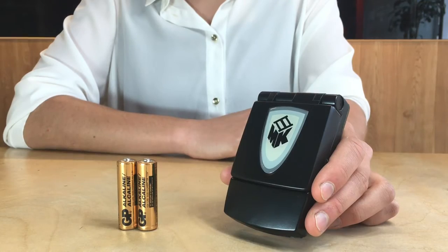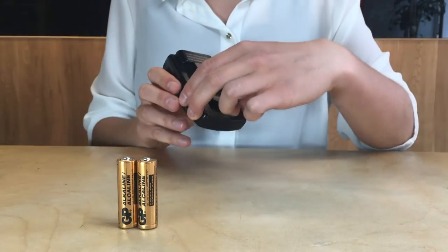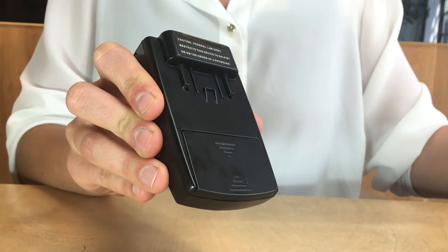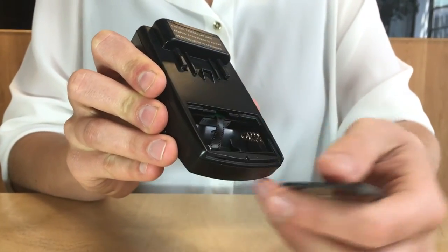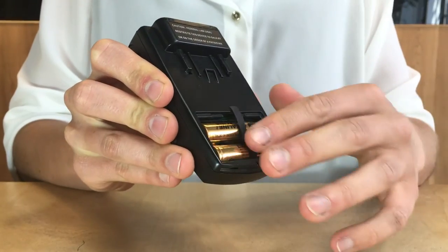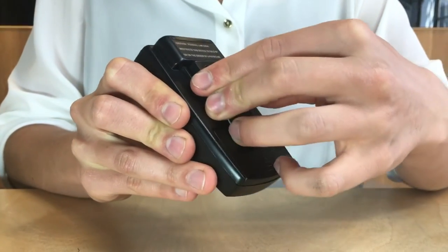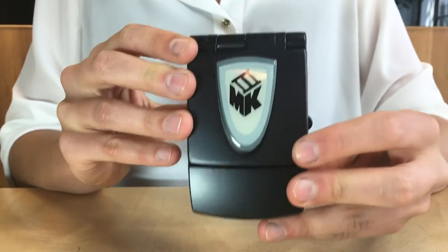We will now show you how you can easily set up your device for use. Remove the belt clip on the back of the device. You can then slide off the battery cover and carefully insert the two AA alkaline batteries. It is important to only use alkaline batteries with the device — rechargeables or non-alkaline batteries are not suitable.